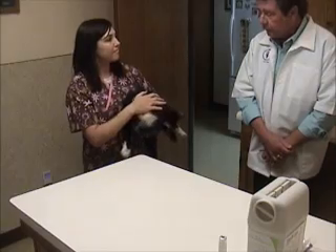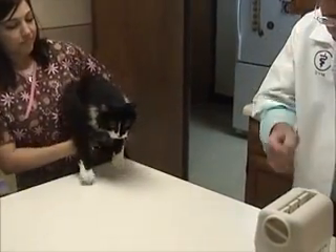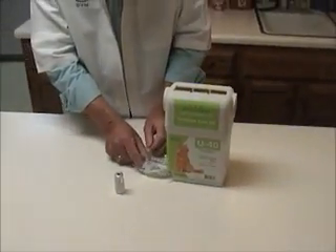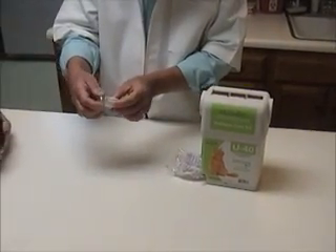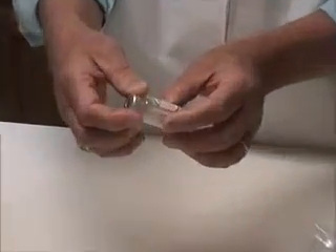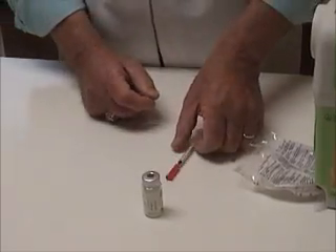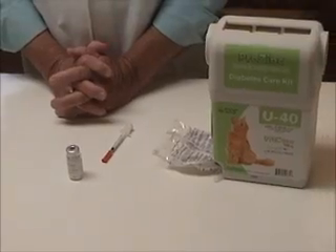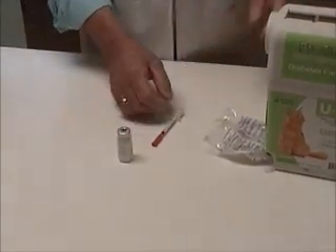Kathy is going to show everyone how to actually do it. I'd like to talk a little bit about how we prepare the syringe and the insulin, getting it ready. The insulin, of course, is a very fragile substance. It has to be refrigerated. You must always be careful not to shake it up too much. You can actually damage the insulin molecule, and also you might introduce tiny little bubbles into the shot which may affect the dosage. But outside of that, it's not difficult.